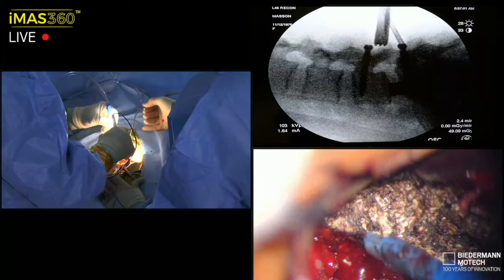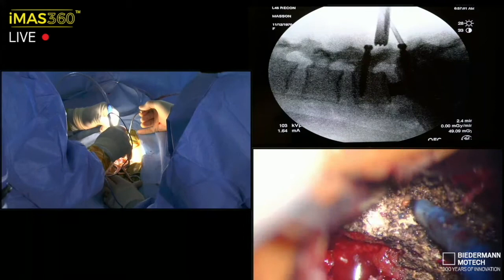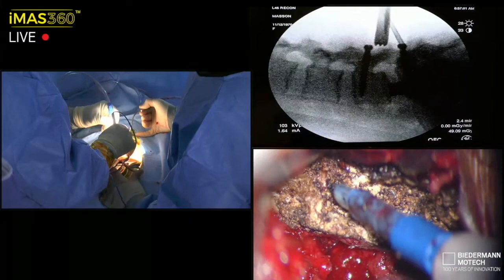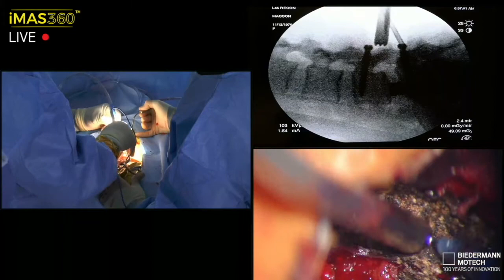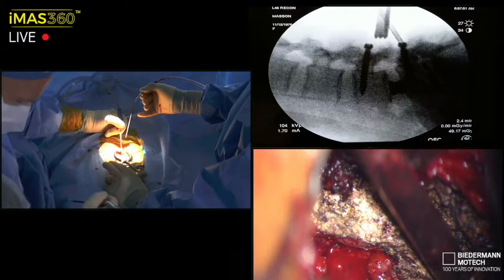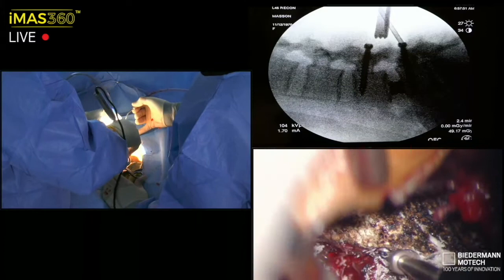I know the most severe tightness is 4-5 left, and it's going to be under that medial facet. So we're going to go from lateral to medial through the facet to that nerve root zone. I'm pretty deliberate with the drill. I use deliberate rather than aggressive, meaning I trust the tip of the drill, the AM8 equivalent acorn, to find that nerve root and decompress it without having to put a Kerrison under it until I've really decorticated and removed that bone and that compression.